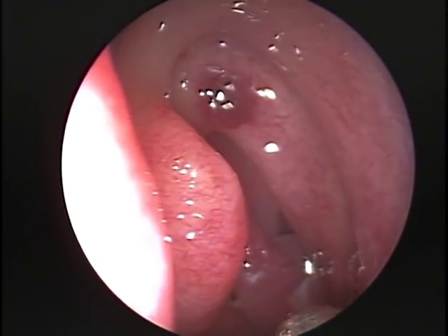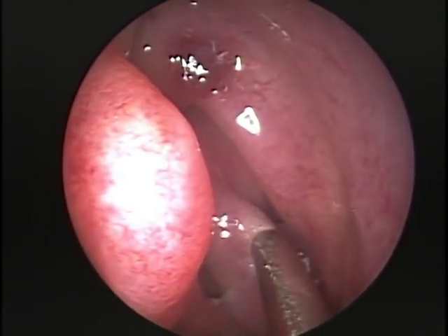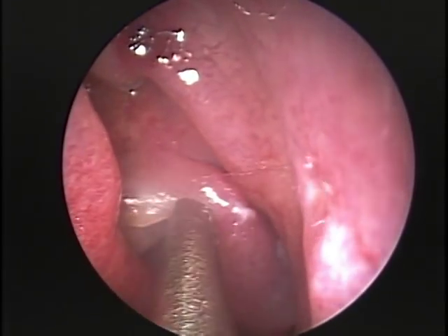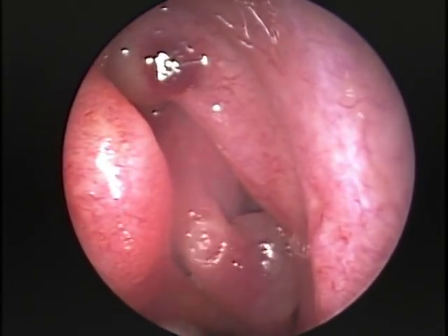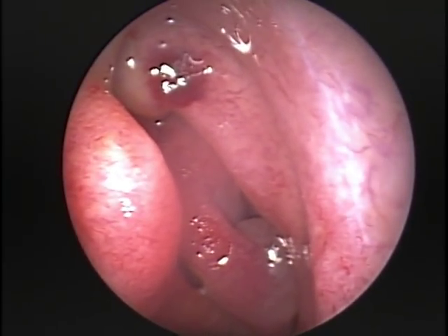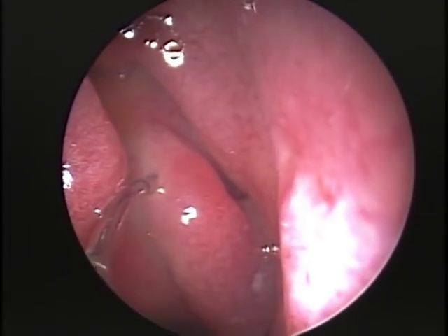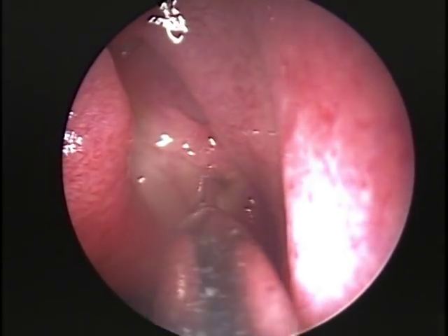This patient presented with nasal obstruction due to a large single polyp hanging down into the posterior portion of the nasal cavity in the choana, which appears on the CT scan to be arising from the middle turbinate but at surgery appears to be arising right off of the ethmoidal bulla. We will put a little local anesthetic into the polyp at its stalk — it is a stalked polyp — injecting local into what appears to be the stalk of the polyp.